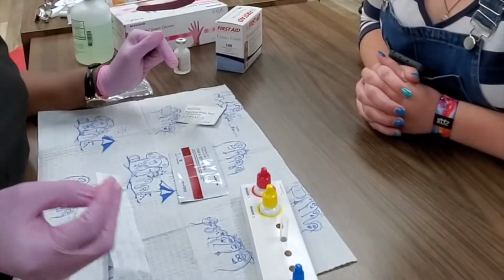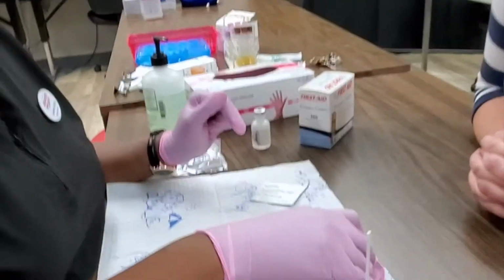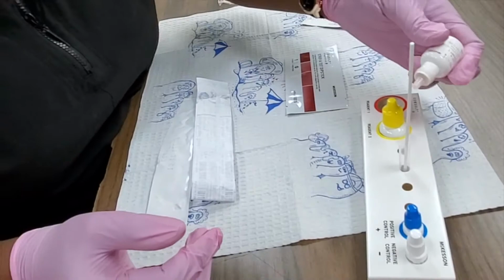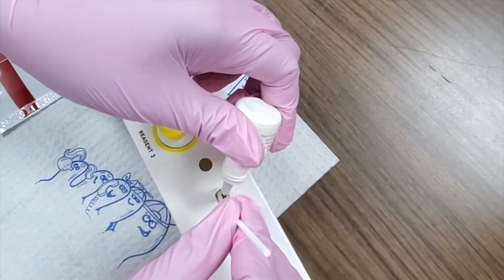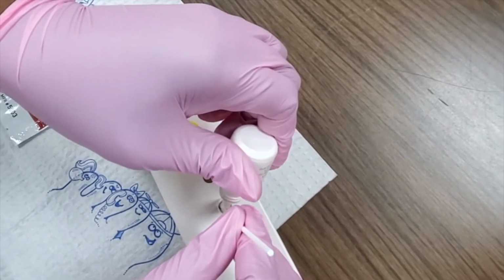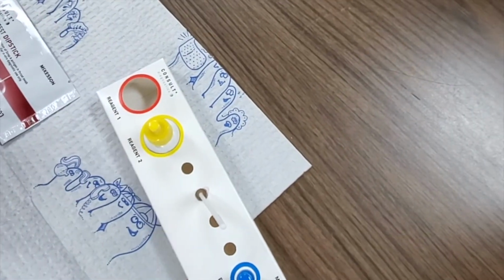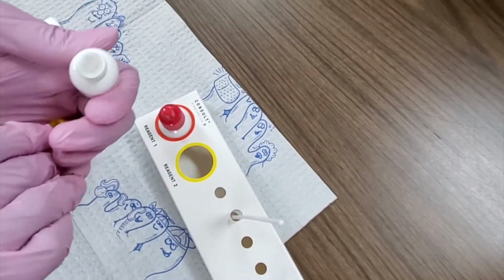Okay, we're going to go ahead and put that into the tube. Add 4 drops of reagent 1 and 4 drops of reagent 2. Being mindful again to keep the caps sterile.